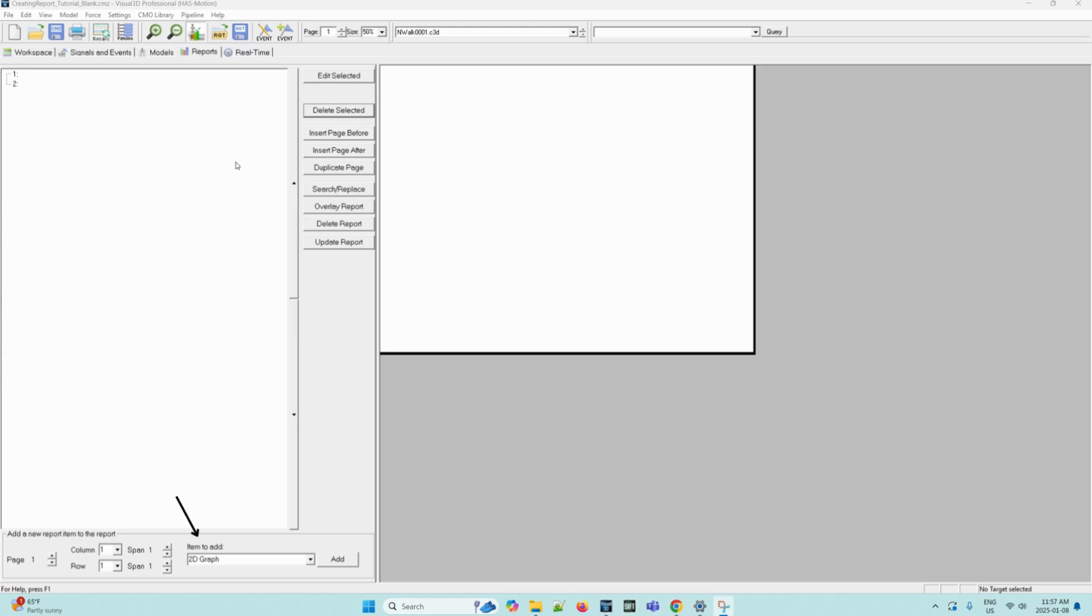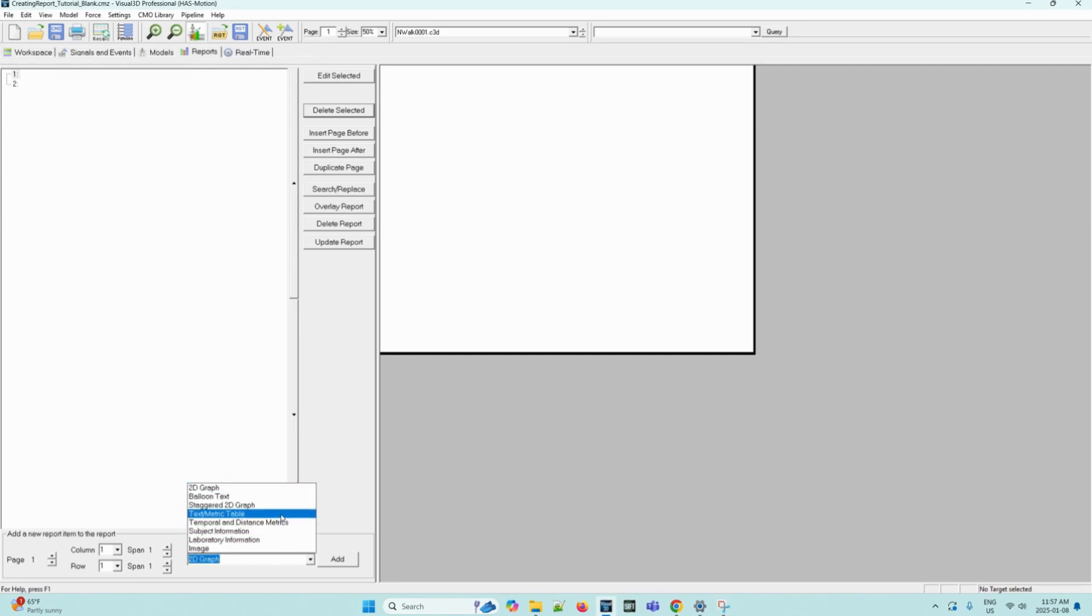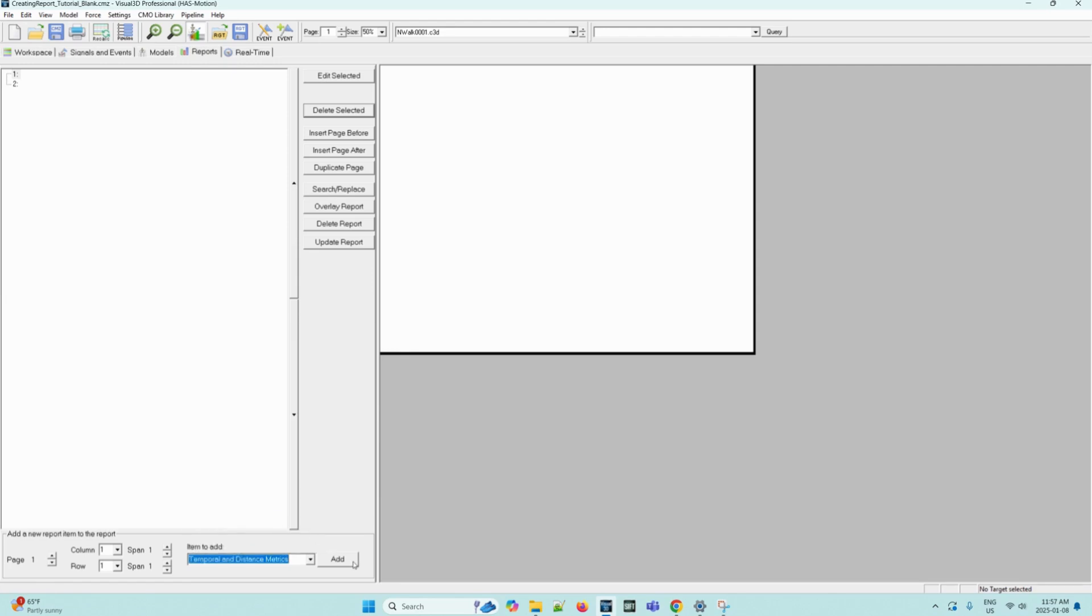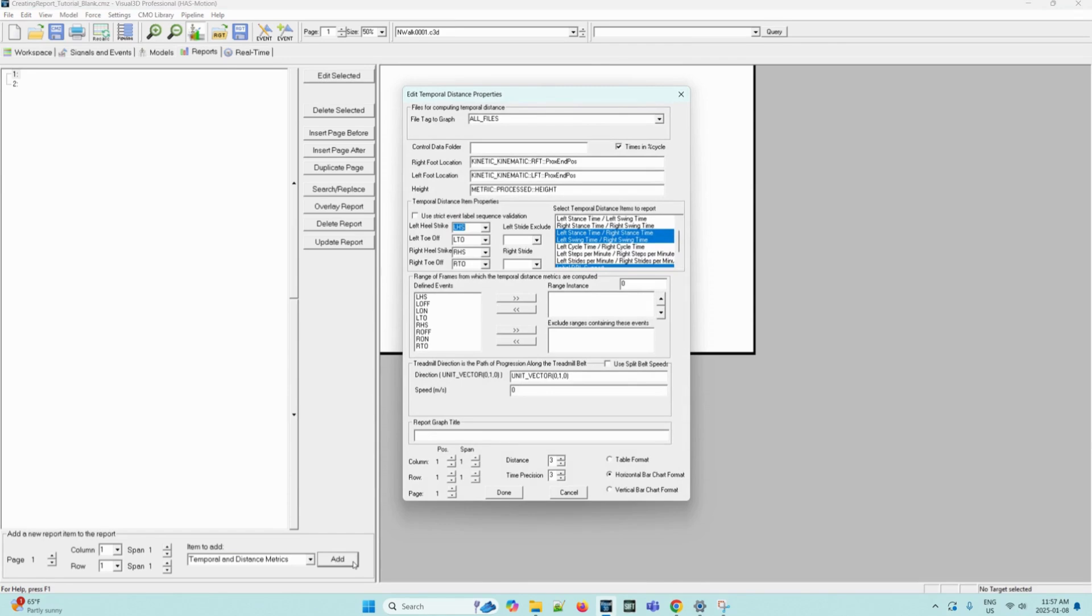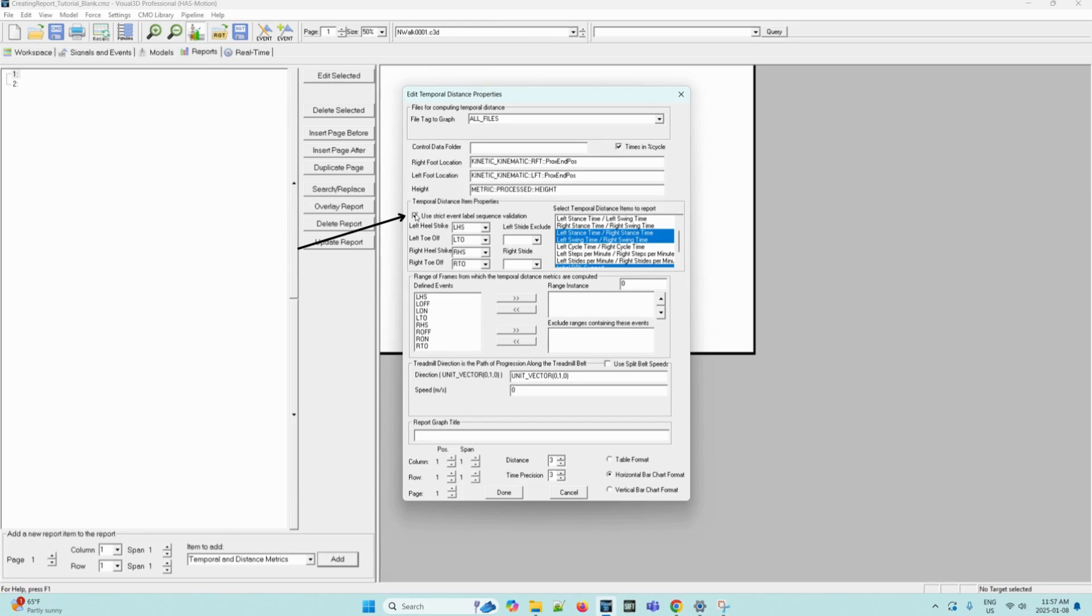So we can select temporal and distance metrics from the item to add selection menu on the bottom of the screen. So we can select temporal and distance metrics and then click add. This will open the edit temporal distance properties dialog box. All features of this dialog box can remain the default, except we can select the checkbox beside use strict event label sequence validation. Selecting this option means that the events must occur in a specified gait order.